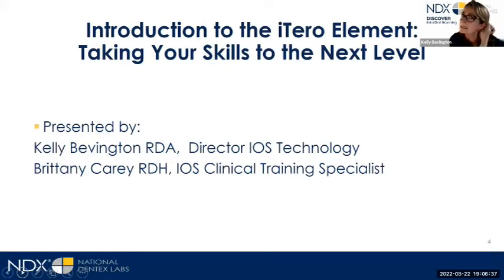And tonight is taking your skills to the next level. So last week was for basics, beginners, really 101. And now we're going to up the game a little bit.